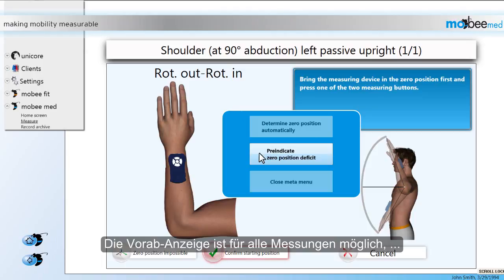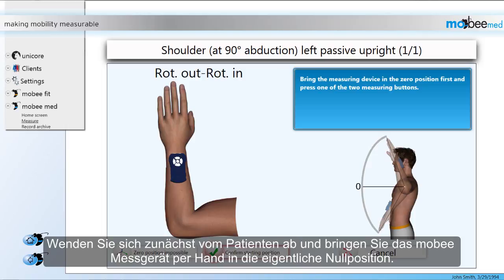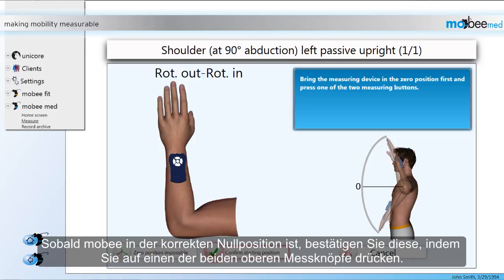The pre-indication of the zero position deficit is available for all measurements, and that is why we are going to look at this solution first. First, step away from the patient and simply hold the Mobi device in the actual zero position. Please note that this step is just a simulation of where the zero position should be and does not happen directly on the patient. As soon as Mobi is in the correct zero position, confirm by pressing one of the measuring buttons on top of the device.